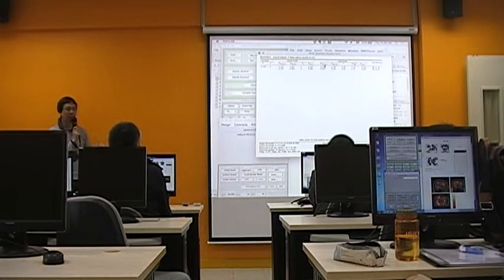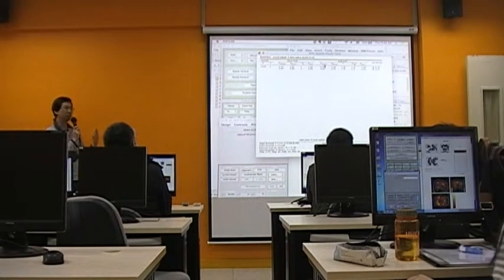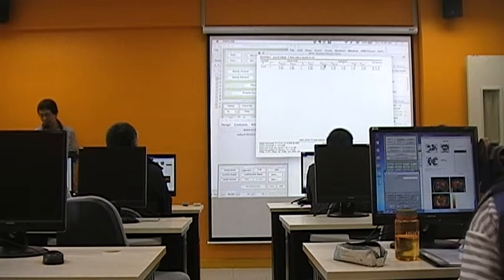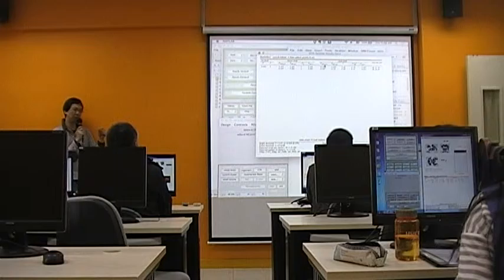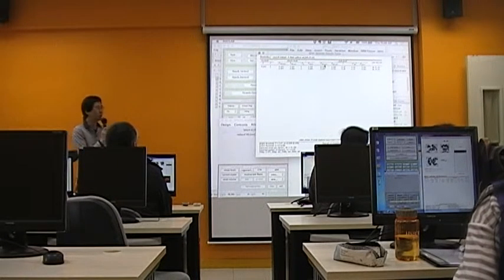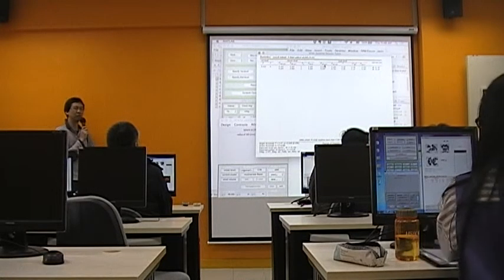If at the whole brain level you could not do family-wise error correction, then you could instead use a region of interest approach. So you would have several different regions of interest, and for each region of interest, you should test it separately.